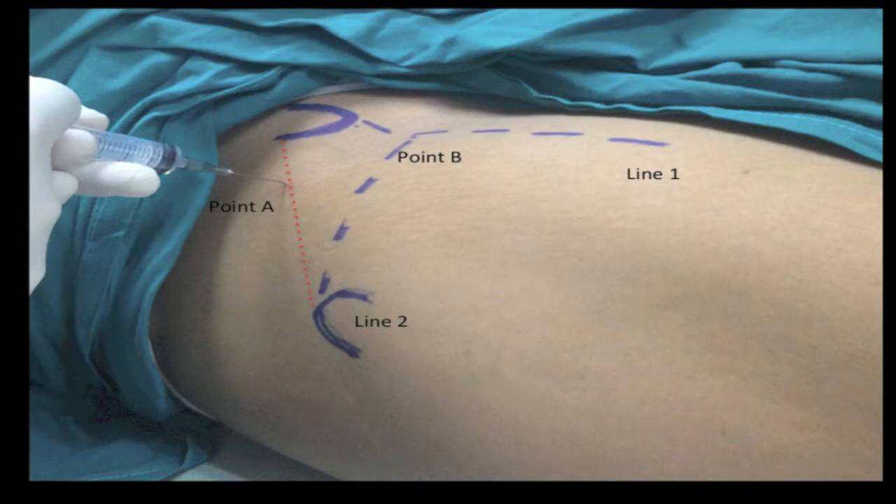These two lines intersect at Point B, which is the target point. The entry point, Point A, is located on an imaginary line drawn between the anterior superior iliac spine and the greater trochanter, shown here as the red dotted line. Point A is one third of the distance from the anterior superior iliac spine, lying on the border of the gluteus medius, also known as the soft spot.